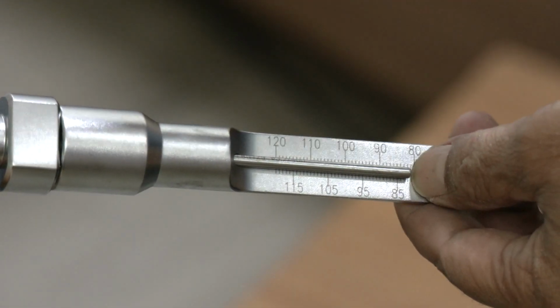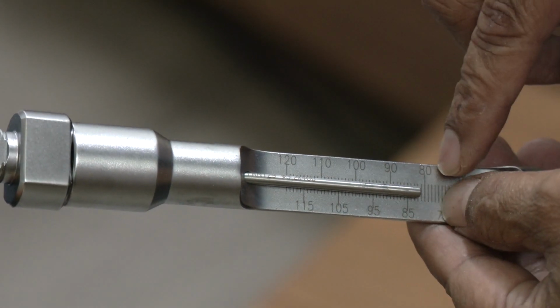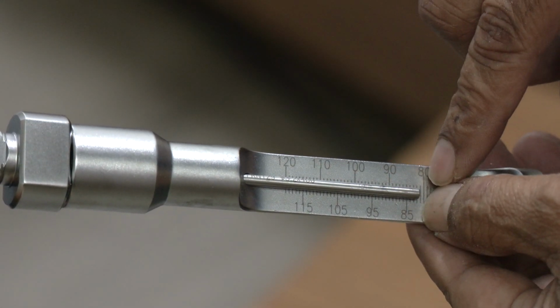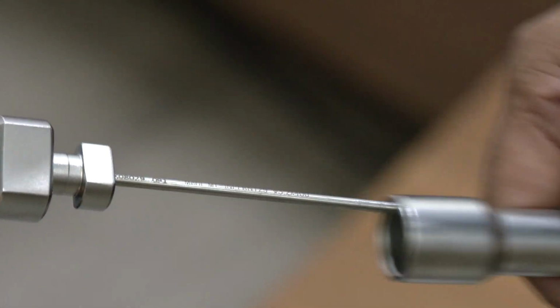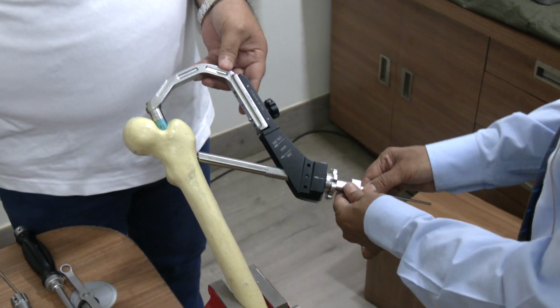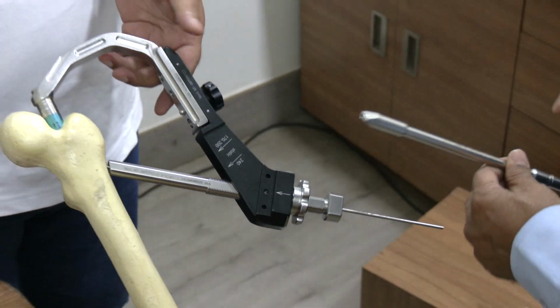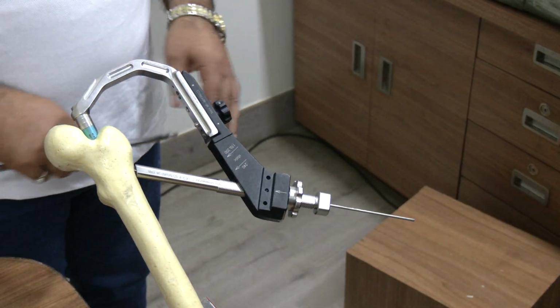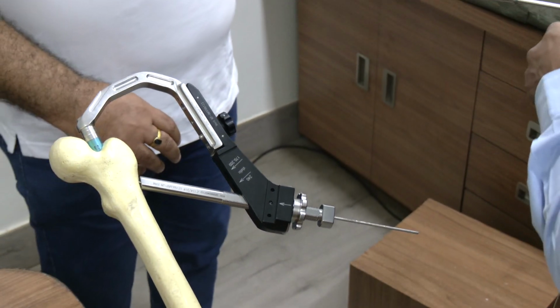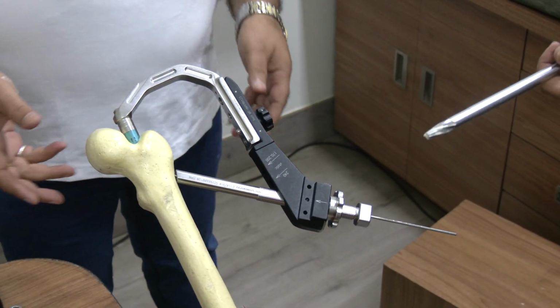So you normally select about 5 millimeter less. Since it is 85, I'll select an 80 millimeter blade in this case. The first thing at this stage is to take out this trocar and the guide pin, and then with a lateral opening device, you open up the lateral cortex.